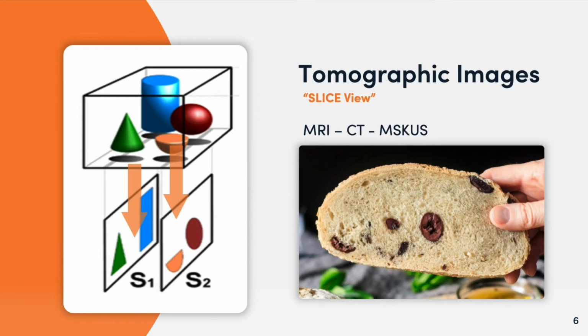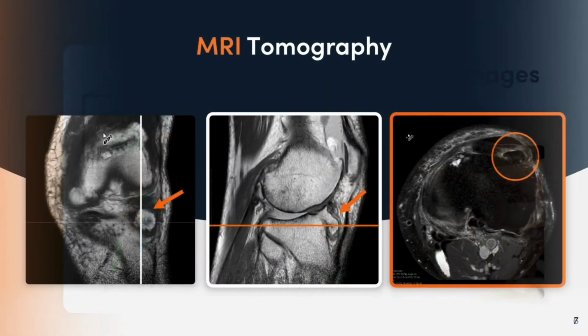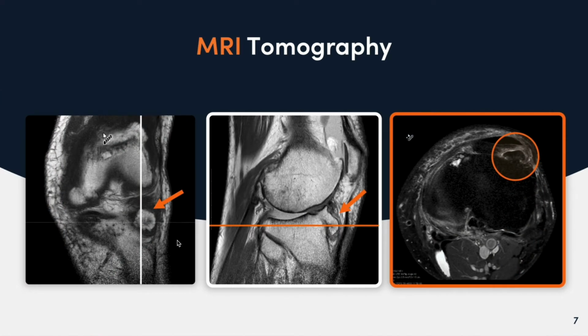Now again, in the real-world experience, this is the exact same patient that we looked at the plain film on. In this coronal slice, we are able to identify some additional information in the tibia that did not show up at all on those plain films. If you look at this vertical line that represents the sagittal view, that is what this picture in the middle is representing, that slice. That slice is now pointing out that there is a bony horn, a projection forward, that was not able to be seen on either the AP or lateral view because it required that the MRI slice it that way.